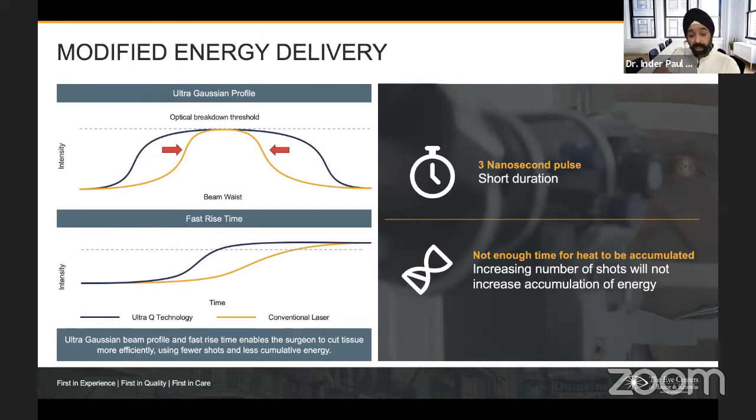What I have seen though is when you have a number of shots, not only do we see gas bubbles, but there are more particles disrupted, so we can get IOP spikes. So for me, my fear has not been retina function for the number of shots, it's more IOP spikes. I used to go to 2,000 shots, 1,500 shots at 6 millijoules, so many thousands of millijoules, and I did not see retina dysfunction, but what I did see was IOP spikes. So that's the reason why I limit the number of shots.